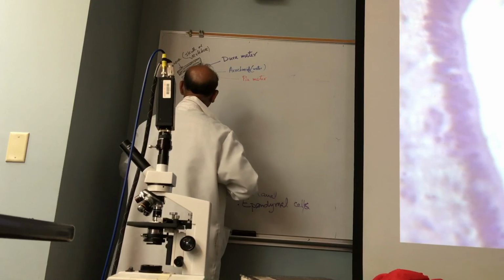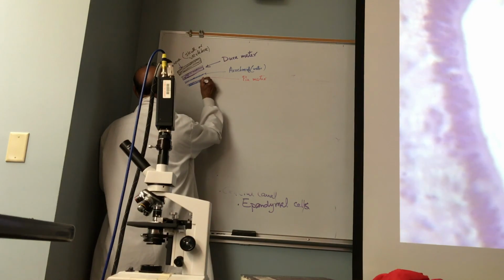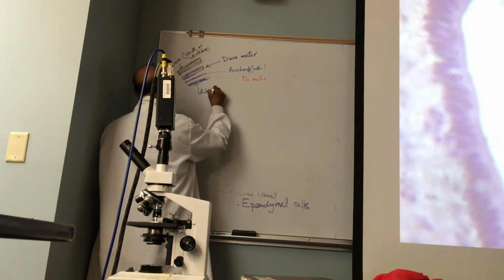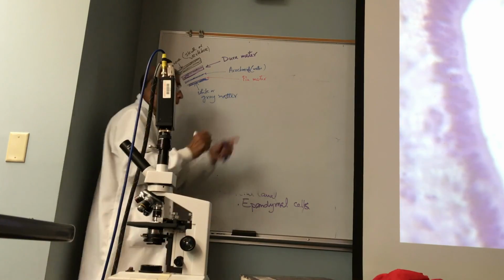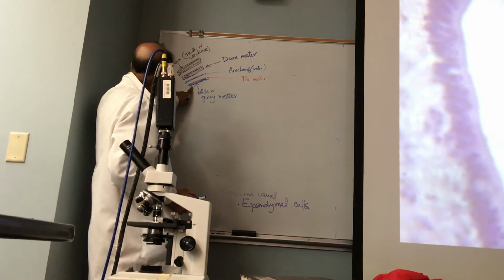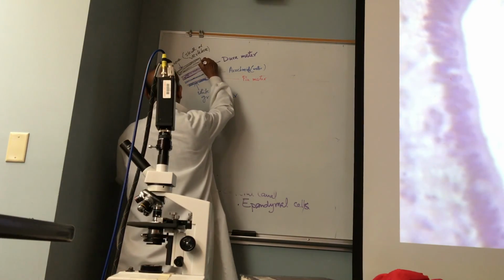And if it is spinal cord, here this will be white matter or gray matter. Okay? Here is white or gray matter, depending if it is spinal cord, because I will be talking about spinal cord, white matter or gray matter. But look at these spaces.